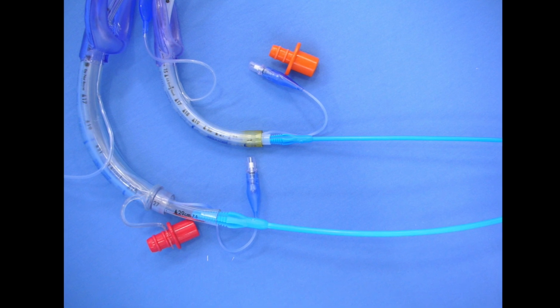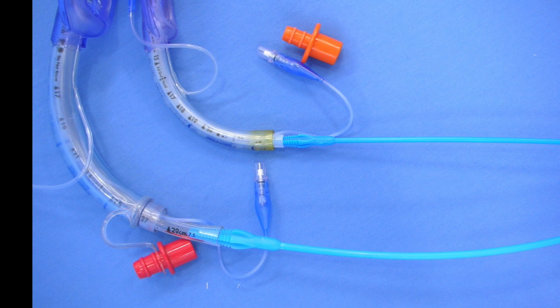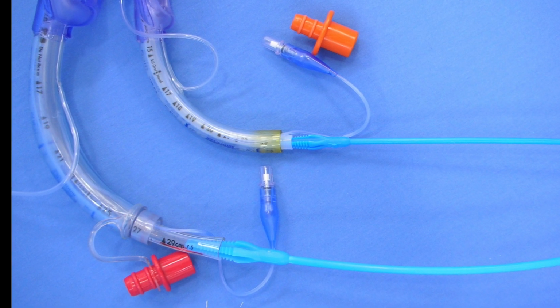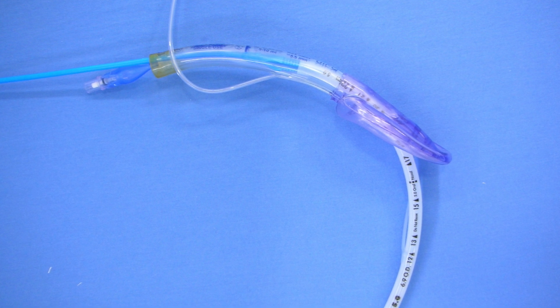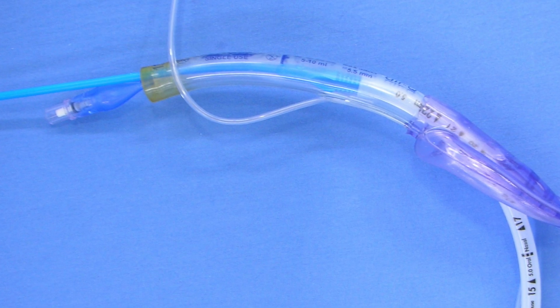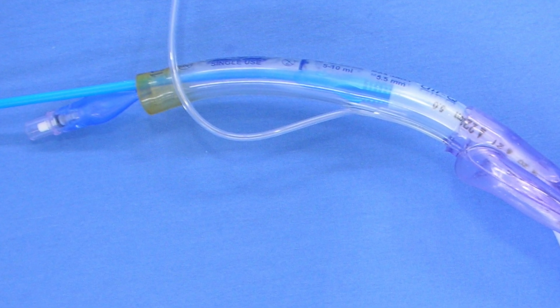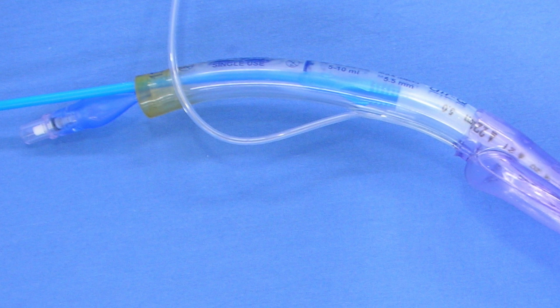Other methods include using specialized stabilizers devised for this purpose, such as these stabilizers made by the AirQ company, which comes in 3 sizes. The 2 largest ones are shown here. Another key aspect for the stabilizer is that the tracheal tube must be grasped in the oral cavity before [...] stabilizer and the pilot balloon will get entrapped within the conduit, necessitating an en-bloc removal of everything from the patient.